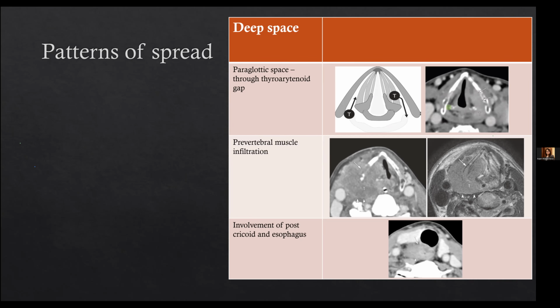because it uses two energies, one lower and one higher, and these enhancing lesions give the image in the form of a color flow. It's a colorful image. So that gives a very clear delineation of which part of the tumor is enhancing, and a very small tumor is also very nicely delineated on a dual energy CT. That much I can say. That is another role of dual energy CT, which we see basically for cartilage erosion also. I am not very sure how it goes over MRI particularly, but definitely over normal CT, dual energy CT definitely has a role.